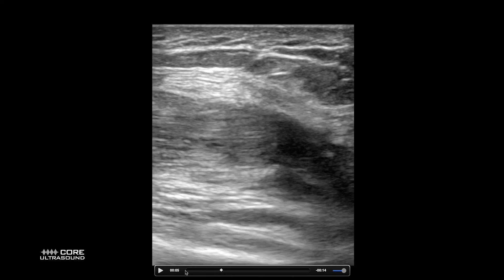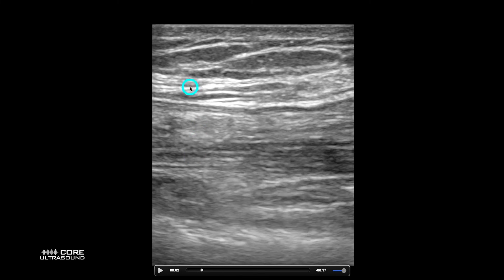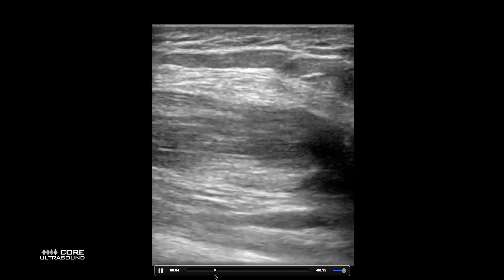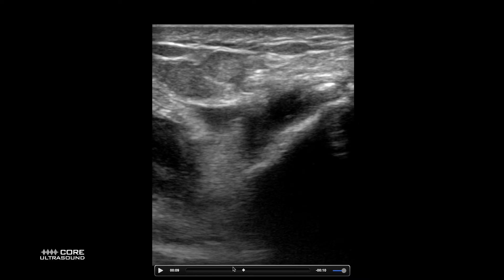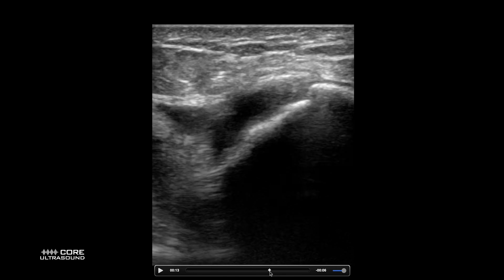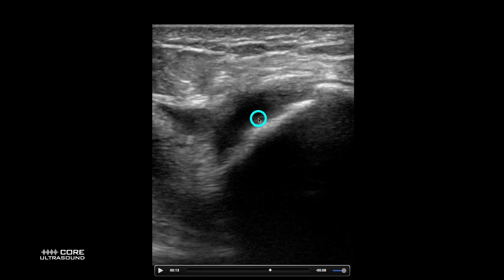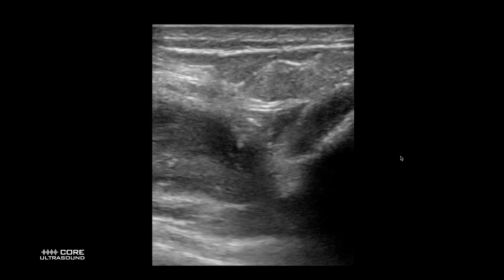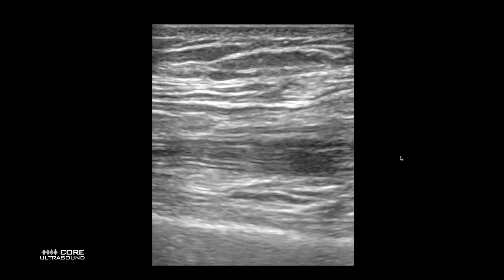Over here we have a quadriceps tendon rupture. We can already see that the anatomy is a bit distorted — it's kind of hard to see, not quite regular. I know that subcutaneous tissue is up here, and this would be the quad tendon. As we move down, there is a huge disruption right here in that quad tendon — basically a complete rupture. We can see the distal aspect of it over here, some fluid, and right here is the patella. We actually have a fracture of that patella — this is what happens with some blunt force injury. So anytime you see any disruption of those fibers, think a tear, especially of the tendons.